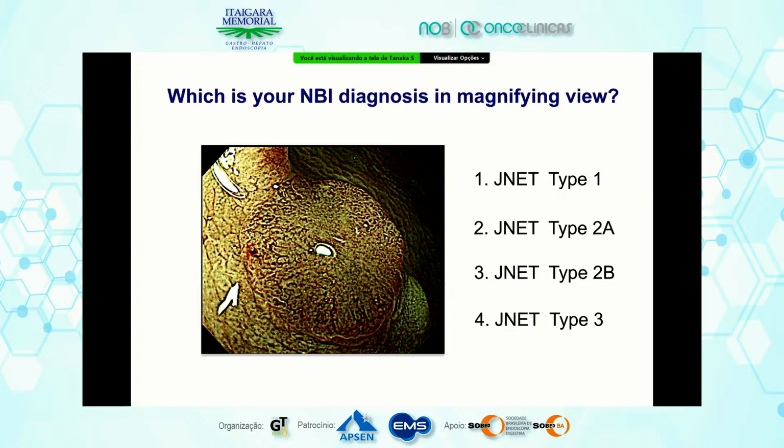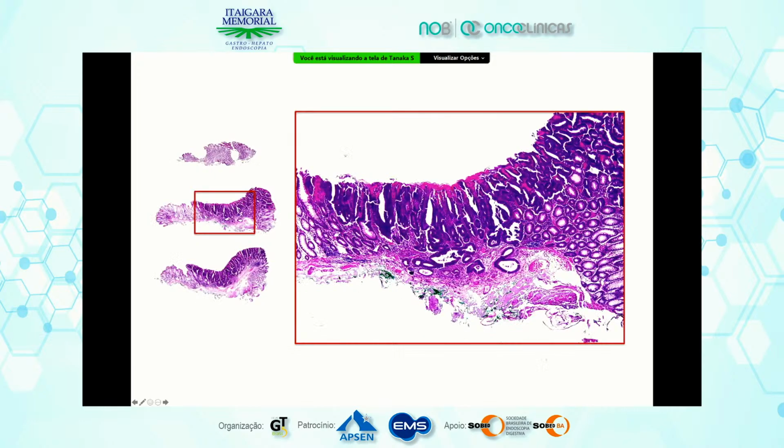Half of the doctors can diagnose correctly. This is type 2B. Type 3. Type 3 is a semi-correct answer. Anyway, never type 2A. This is EM. We conducted EMR. This is SM invasive carcinoma.